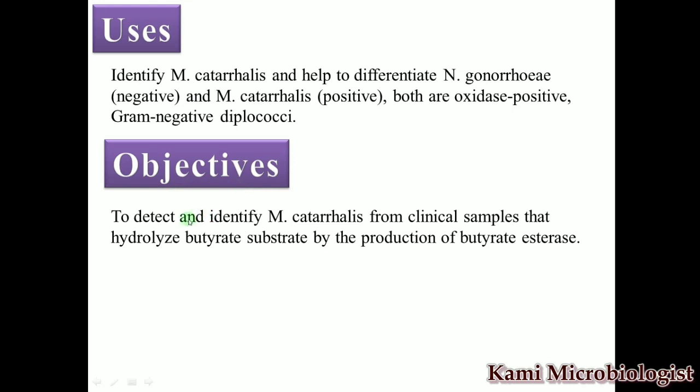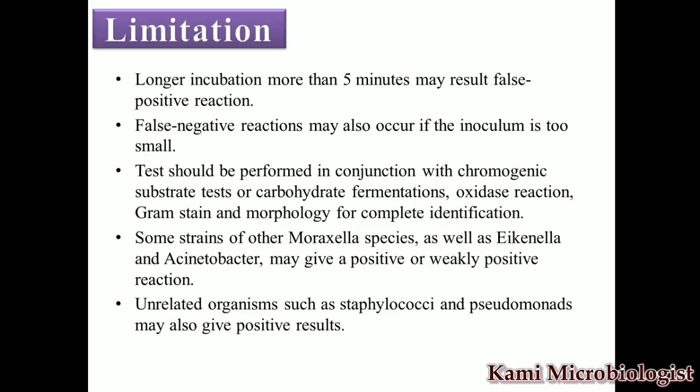Now the objective says that we mostly use this test to detect M. catarrhalis from clinical samples, which hydrolyzes the butyrate substrate by the production of butyrate esterase. Let's see the limitations of this test, what type of errors arise while performing it.